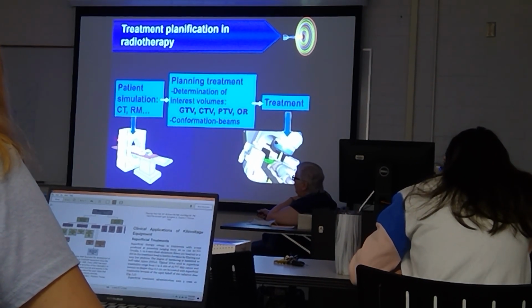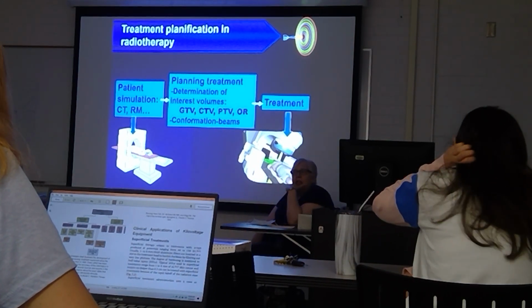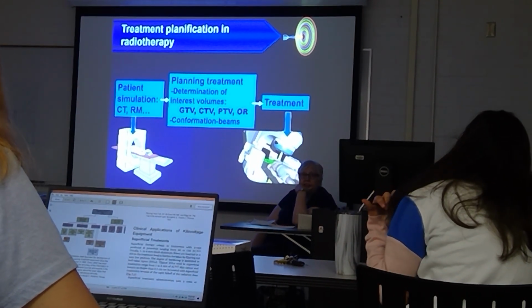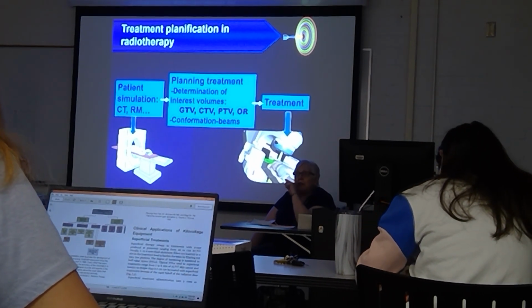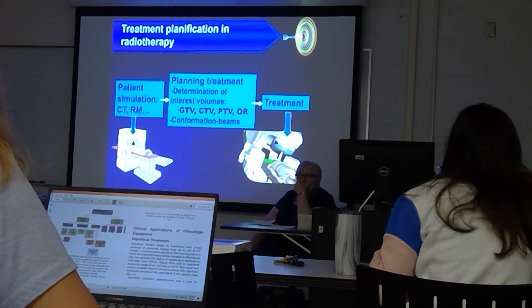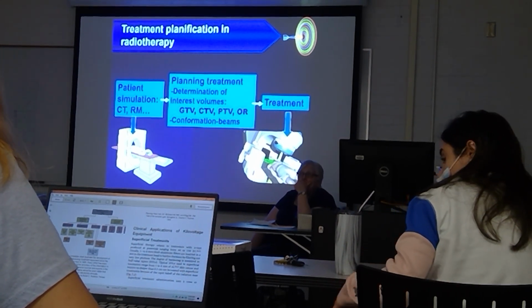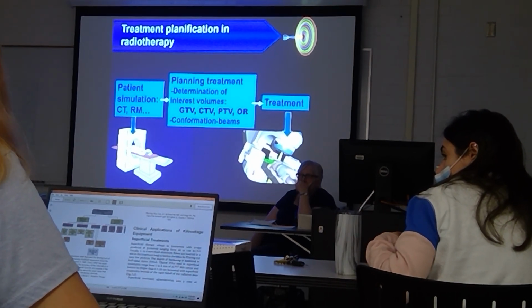Now they're putting in the patient feet first. Is that normal? Has anyone actually had the chance to see a CT done yet? Yeah. Which way did they normally put the patient in? The therapist said we try to request that they do it head first, but sometimes if we don't let them know, they do it feet first, and it just makes everything a little more complicated.